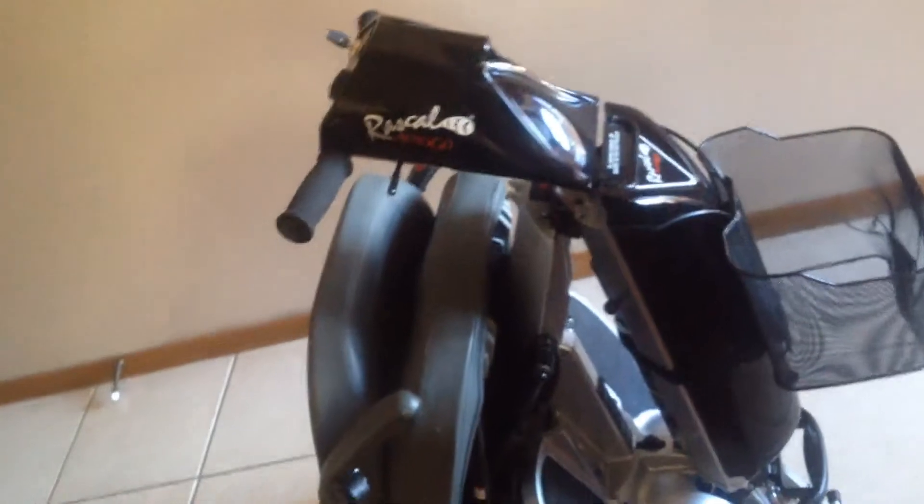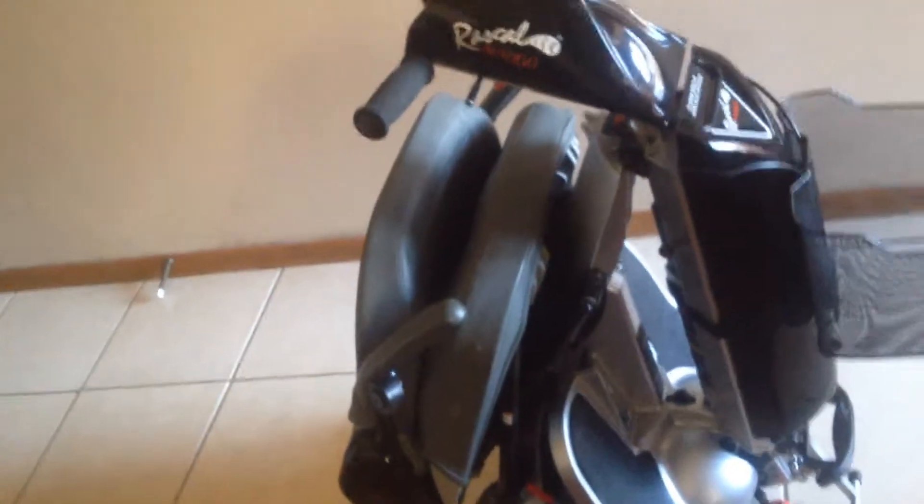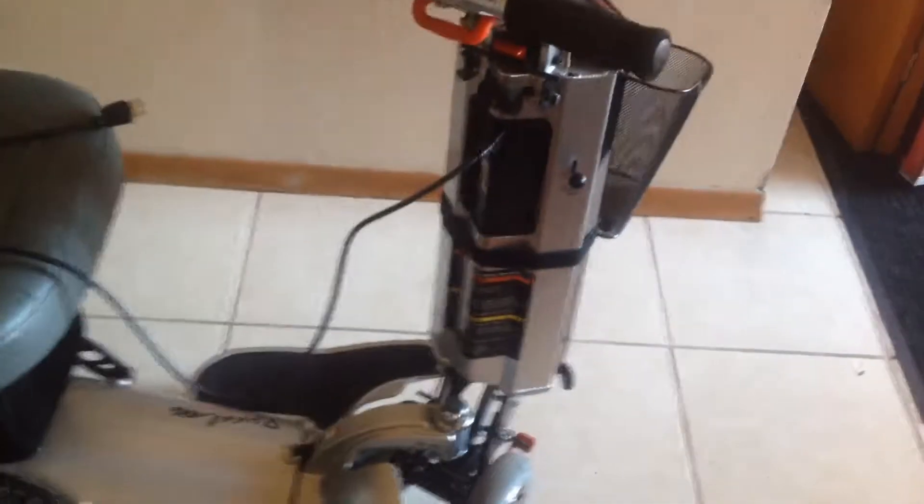There are a few Rascal 550s on Kijiji — some that are really expensive, some that are cheap but have worn batteries. This one has a brand new battery pack on it. The charging is dead simple — one cord, the same cord you'll find in the back of your TV or on your computer. So you don't have to lug around weird power adapters like you do with your laptop.